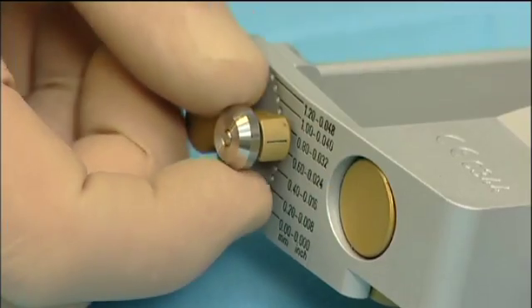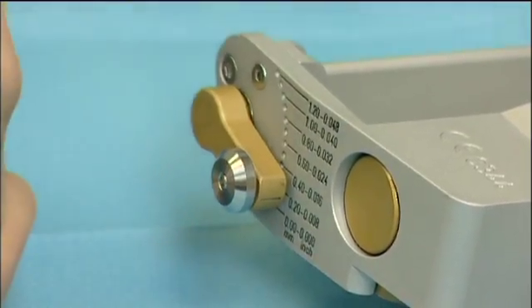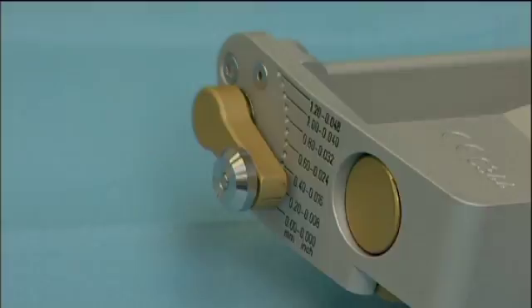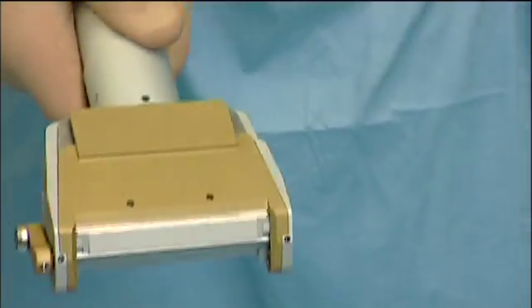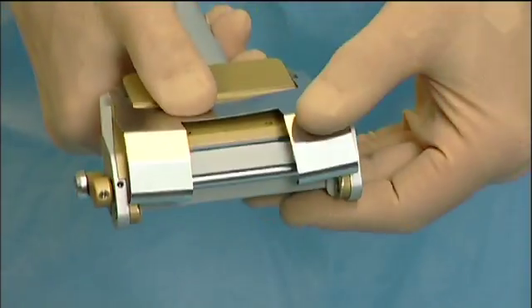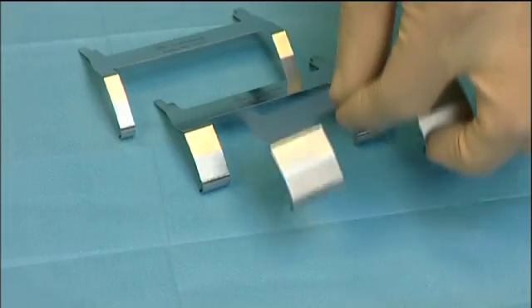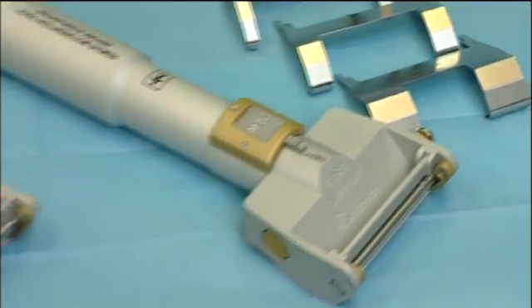The graft thickness is adjusted by means of an adjusting lever, fixed at predetermined positions to prevent accidental change. The dermatome can be provided with a width-reducing clamp to limit the cutting width. Several clamps are available for both the D42 and the D80 dermatome.